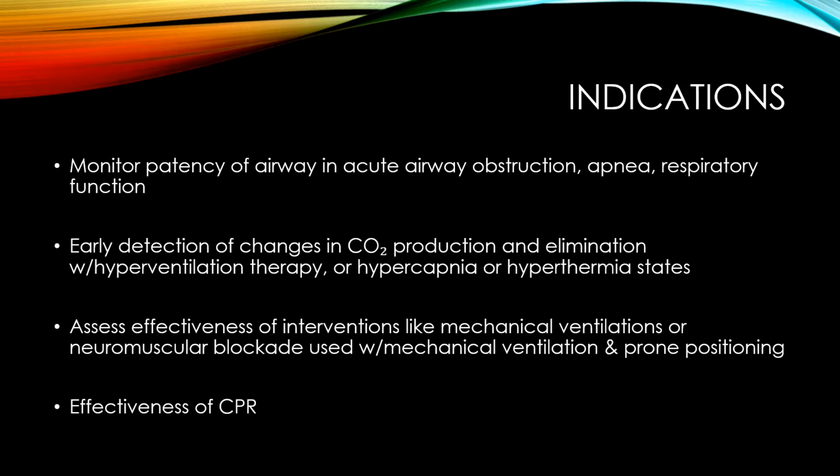You can also use it during CPR status. If there is effective CPR compressions being done, it should show an end tidal CO2 reading of greater than 15 millimeters of mercury. If the reading is less than 15 millimeters of mercury, we need to assess to make sure the compressions are being done correctly. Low end tidal CO2 values of 10 or less may be caused by either poor compression technique or it could be low perfusion and metabolism after a long downtime, despite good compressions.